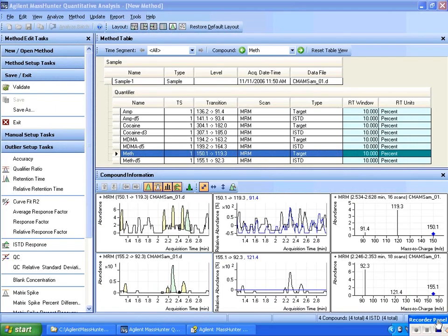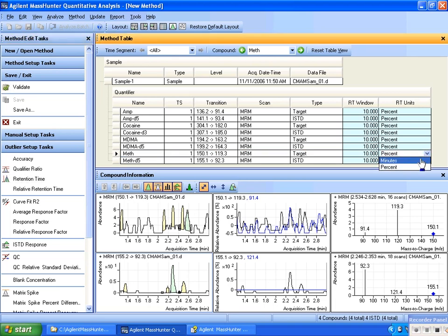And I'll show you. Let me look here at the method editor. The outlier setup tasks are here on the Explorer bar, and I'd like to focus in on the retention time and the relative retention time. So let's see how these are set up. I look at the retention time. I can see for methamphetamine here, there's the transition, and the expectation of where that peak appears is within 10% of the expected. If it's within that, then it's within the limits. I can also give it an absolute limit of minutes, but I'll stick with percent here.